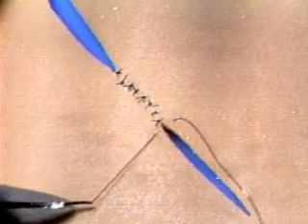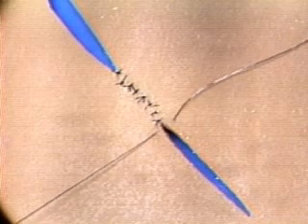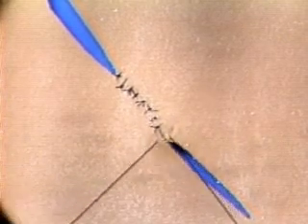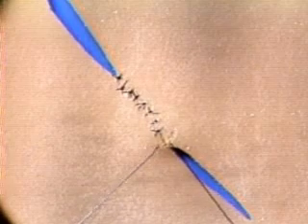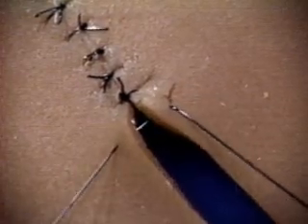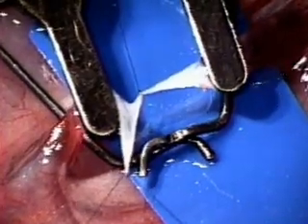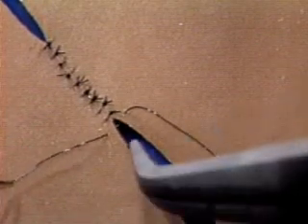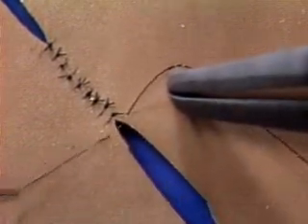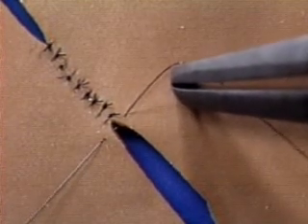There are 2 things to avoid in pulling the thread through. The first thing to avoid is to have the thread coming through the tissue at an angle like this, rather than in a straight line like this. It's dangerous to have it running at an angle because with just a little drag on the thread, that angulation makes the thread tend to cut through the tissue. Glove rubber may withstand this, but a blood vessel won't. To avoid this problem, use your right hand forceps whenever you need to as a pulley so that the thread passes cleanly through the tissue in a straight line.